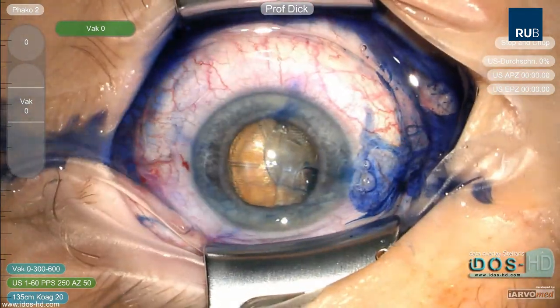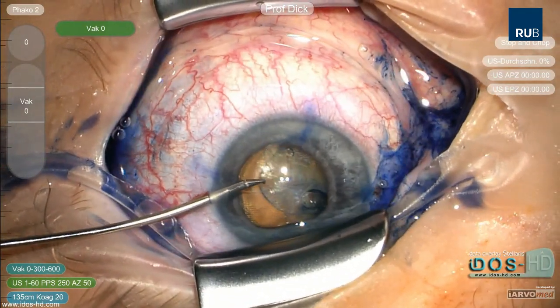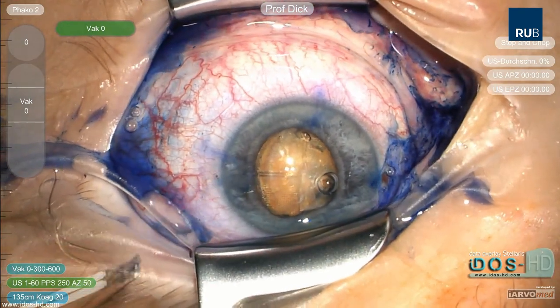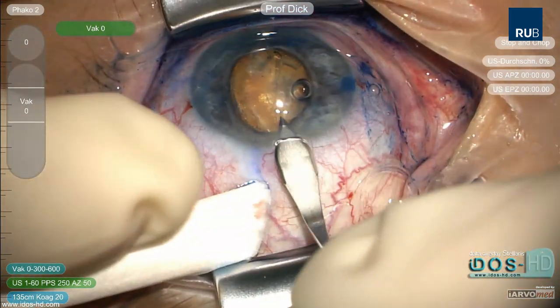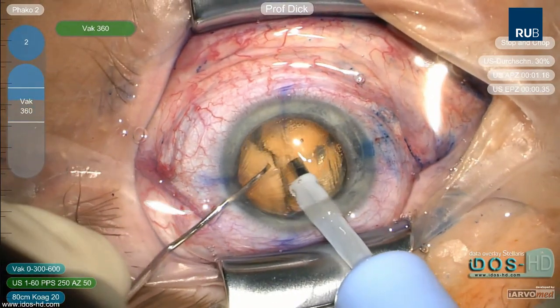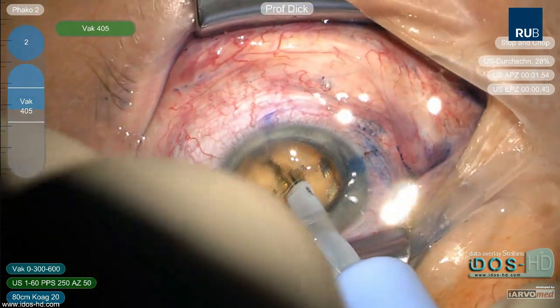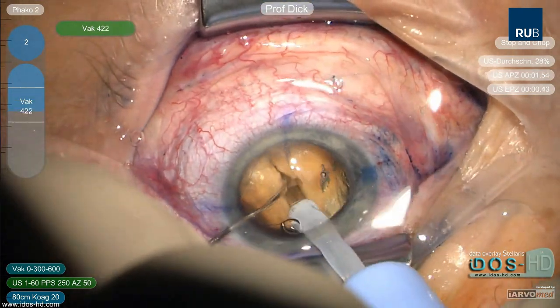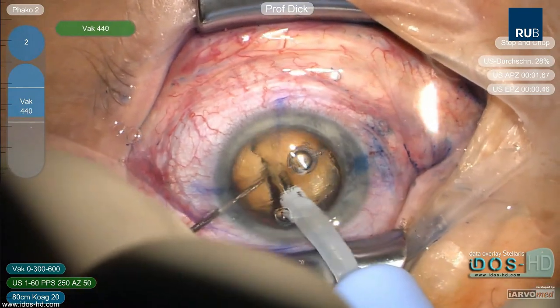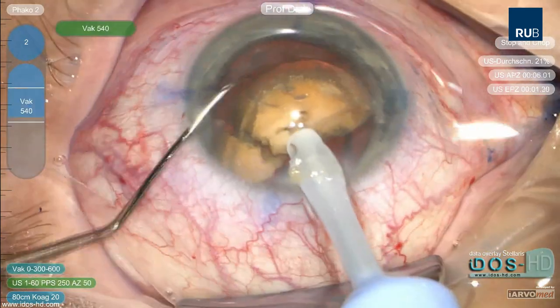The anterior capsule disc is removed with micro forceps. A 2.75mm main incision is created. The nucleus can be cracked along the pre-cut main lines, and a minimal amount of phacoemulsification energy is necessary to remove the lens.